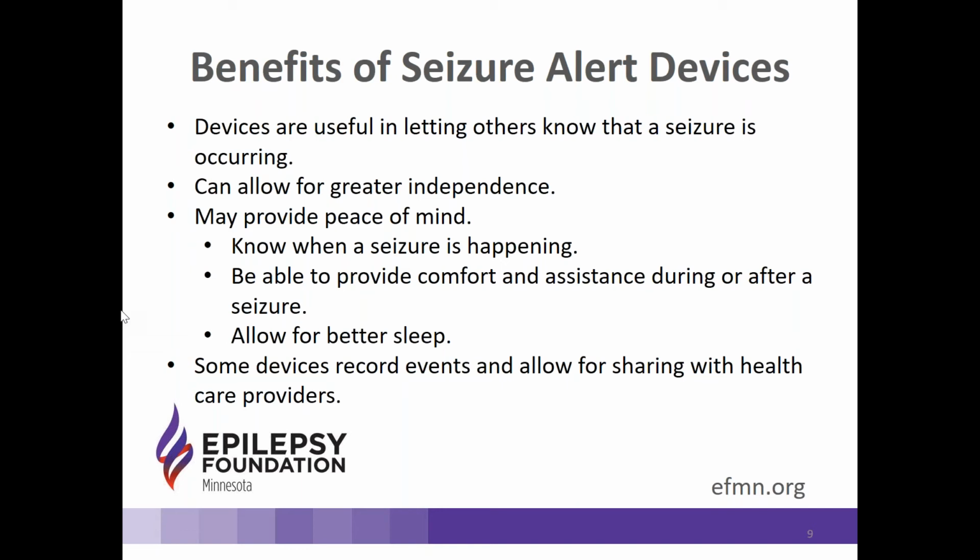And there's a lot of reasons that might happen, but one of them might just be that it can be difficult to even know how many you're having and when you're having them if they're happening in your sleep. So having a record from these devices can provide more accurate information. And when you can provide that accurate information to your doctor, that can help them make better treatment decisions for you and really be able to recognize what the patterns are for you.